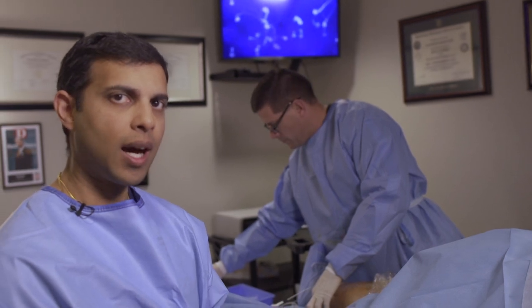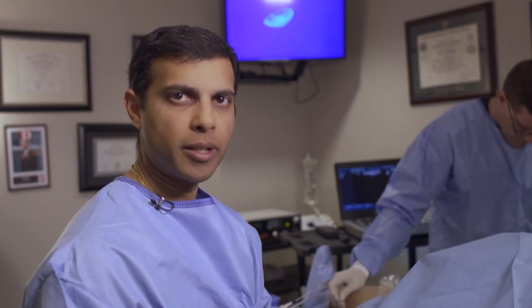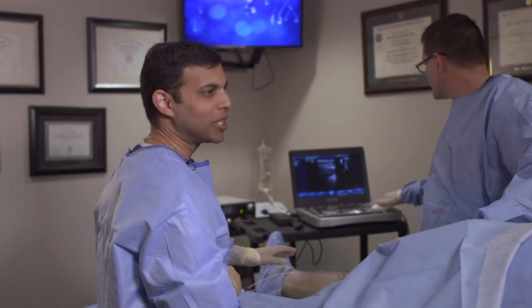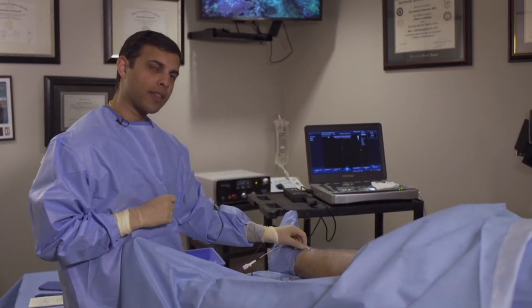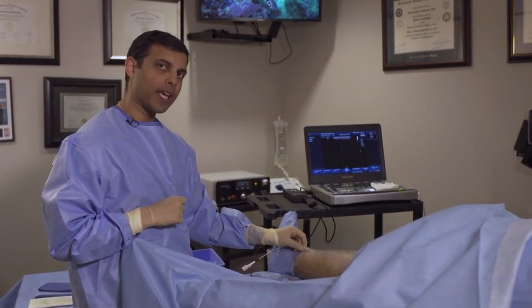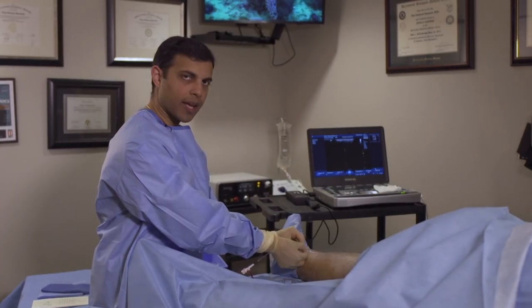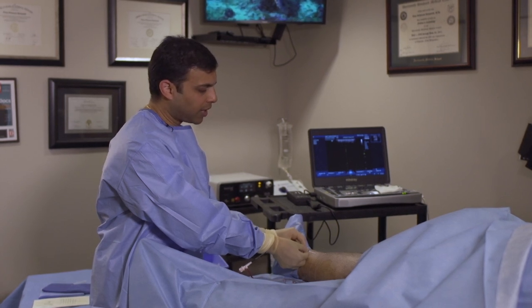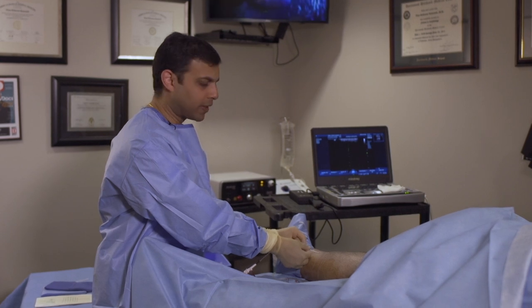The laser itself is very hot, so we don't want the patient to feel it. We're going to basically bathe the vein with this local liquid anesthetic. Once we complete that, we'll be ready to proceed with the actual laser ablation. You doing all right? I'm doing fine. Great. All we're going to do is a gentle pullback of the catheter as the laser is being activated — gently and slowly pulling the catheter out of the leg. As we're doing this, the laser is closing off that varicose vein.